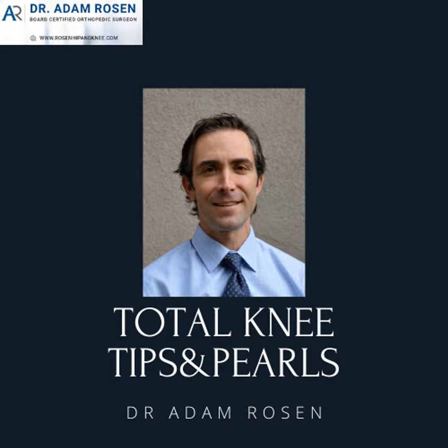But whether you have to take it out or not, what I'm doing again is exposing the lateral side, identifying the quad tendon, identifying where the synovium starts and stops, and excising that synovium off the extensor mechanism below the quad tendon, down into the gutter, off the femur, again paying attention to the lateral collateral and its insertion on the lateral epicondyle. You want to get into the gutter and anything below the patellar tendon, which may inhibit your ability to visualize the knee.